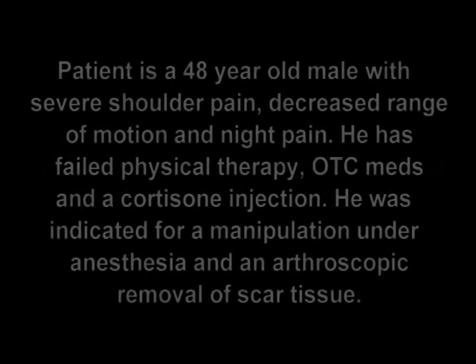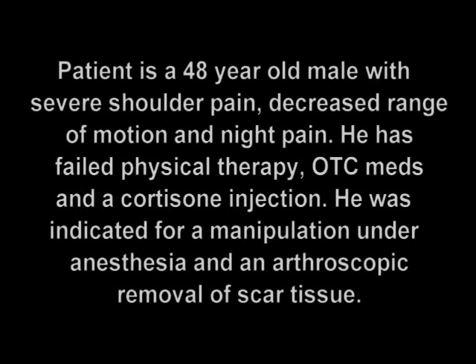Arthroscopic Frozen Shoulder Release by Michael Bach and Randy Clark. The patient is a 48-year-old male with severe shoulder pain, decreased range of motion, and night pain. He failed conservative management and was indicated for manipulation under anesthesia and arthroscopic removal of scar tissue.